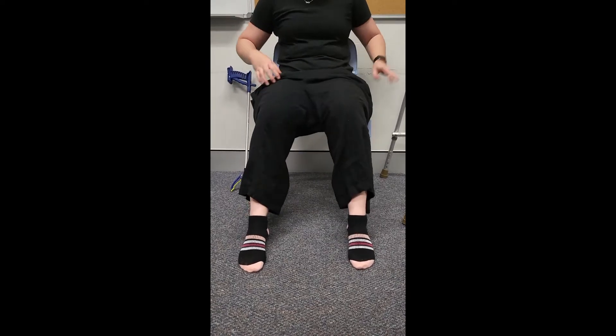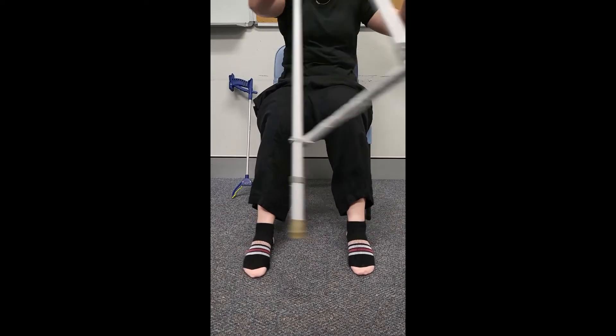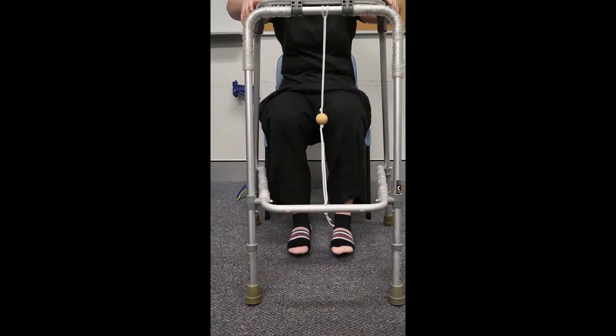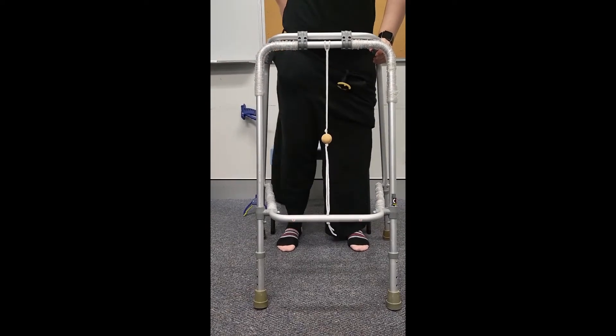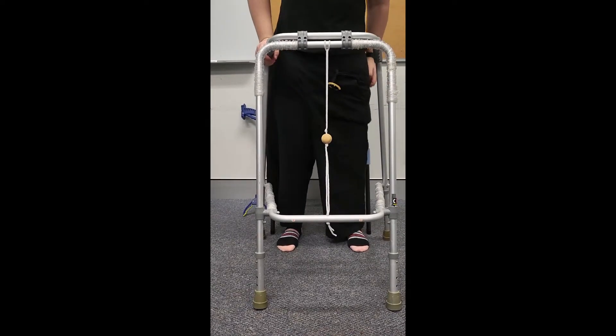Pull the pants up the thigh as far as possible while seated using your hands, and then stand safely using a walking frame or other supports as necessary. Finally, pull the pants up the remainder of the way.